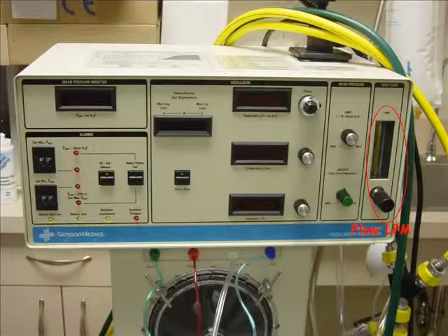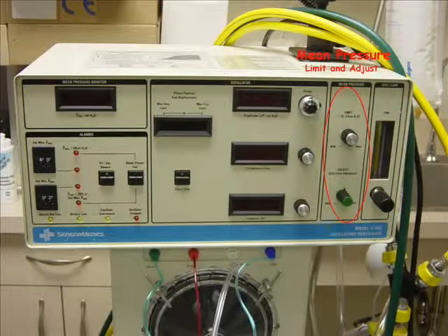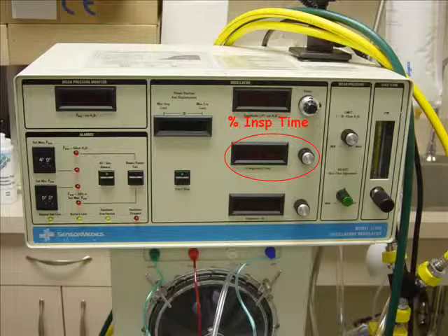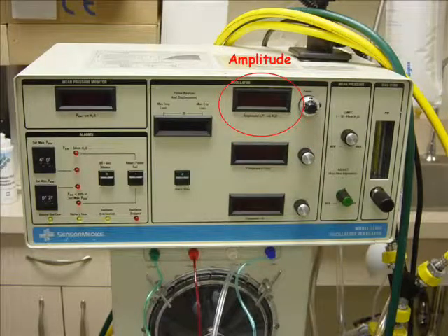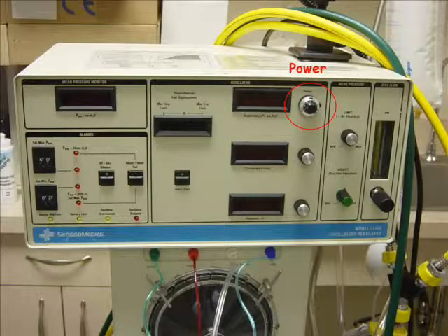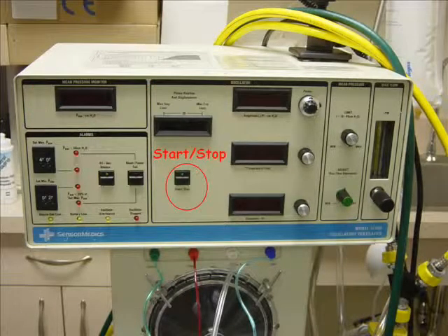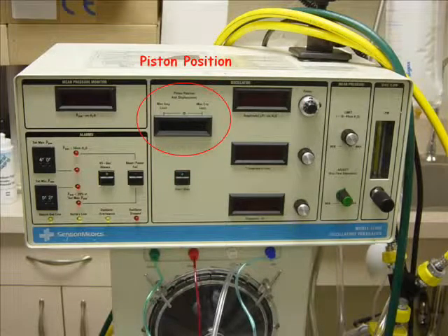You're going to be looking at the flow, liters per minute, also the mean pressure limit and adjust knobs, two of them, frequency, and you can change that with a knob to the right, inspiratory time, knob to the right, and then amplitude, and that's changed with the power control, which is also on the right. Now you see the mean pressure digital display, the stop-start button, and then we're going to look at the piston position. Now the piston position is controlled elsewhere.